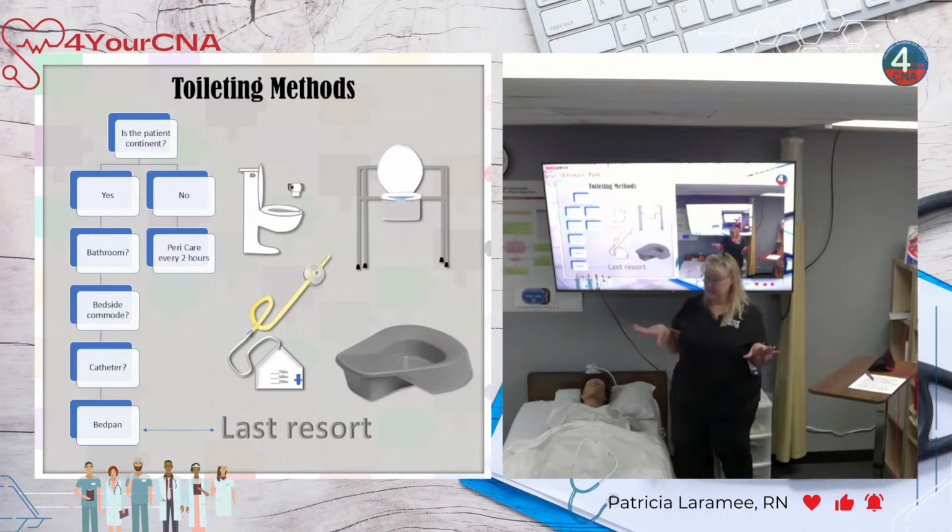Make sense? If you're having surgery, catheters are going to be important, because when we put you to sleep, we put every part of you to sleep, including that little valve, which means you're going to pee on our sterile fields. We don't like that. We don't want pee in the ER or the OR. So we usually put a catheter in while you're under to help divert the urine that's going to, not might, come out, going to come out. Okay. And then they remove it before you ever wake up, and you didn't even know you had one.